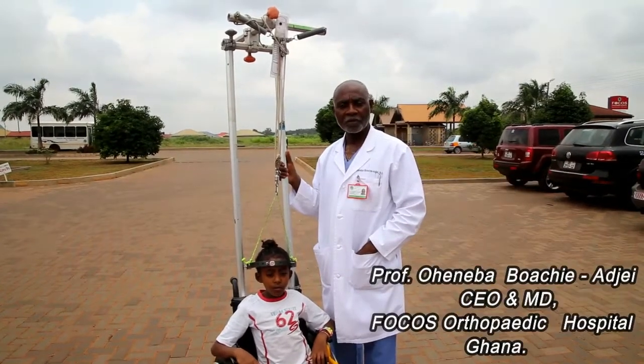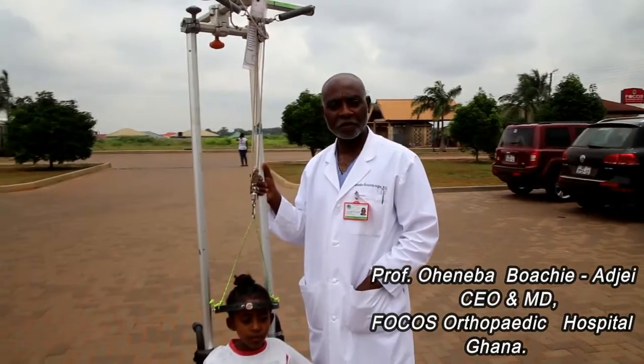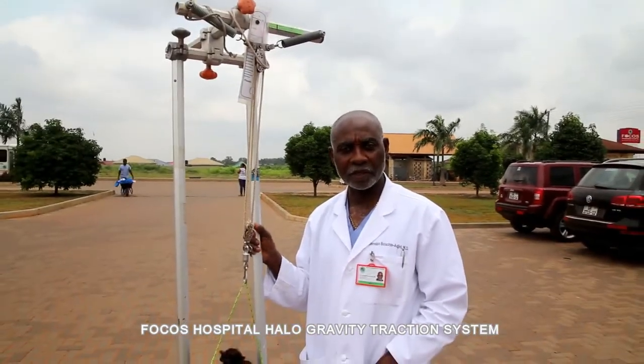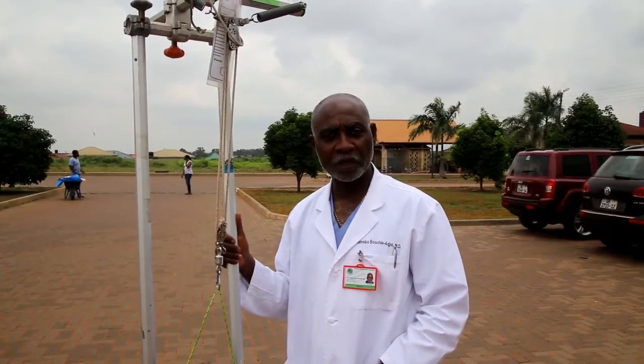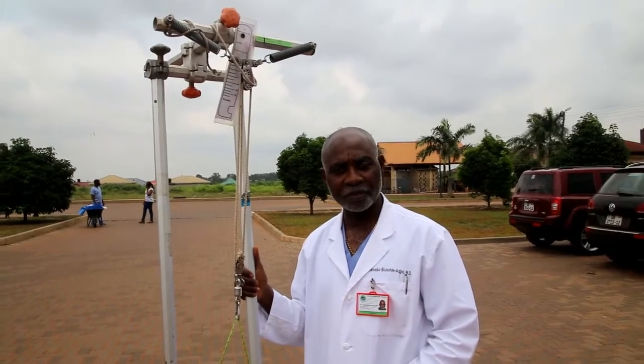I'm Professor Buwachi Ajay, the CEO and Medical Director of the Focos Orthopedic Hospital in Ghana. This video is going to demonstrate the spring-loaded halo traction system that we have used at this hospital, and how it is set up and applied for a walker, for wheelchair, and also in bed. Enjoy the video, and comments will be appreciated.